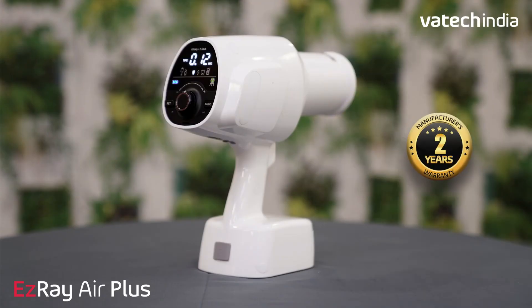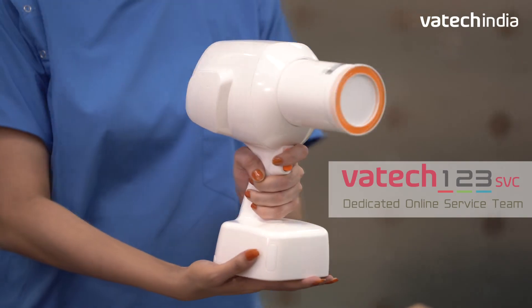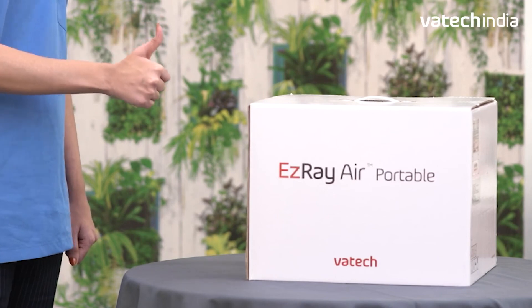EZ-Ray Air Plus comes with a 2-year manufacturer's warranty at a most reasonable price, and you can avail service support directly from the company. This safeguards your unit and helps you focus on your practice with peace of mind.